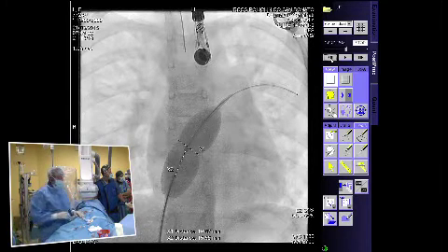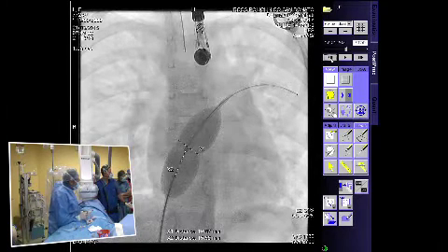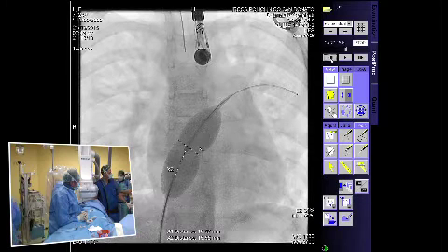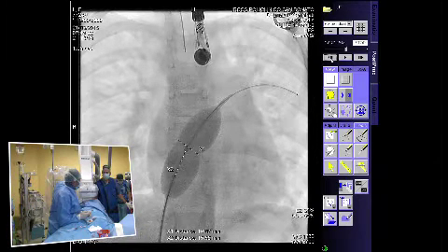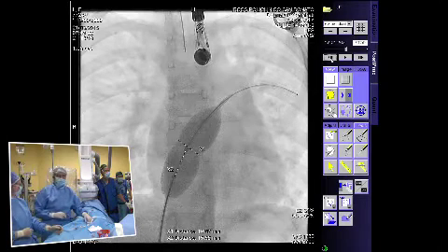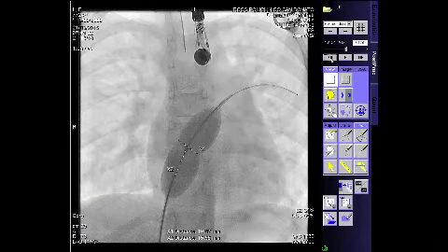We can ask the audience, people who want. So you have 15 size or anyone? People who voted. Who wants something bigger? So there are more who voted for the 15. 15 or 16? 15. Aki, shall we follow the audience? Absolutely. Okay, Aki would agree that 15 is going to be enough, so we select the 15. All right. Please give us a 15 millimeter ASD occluder, please.